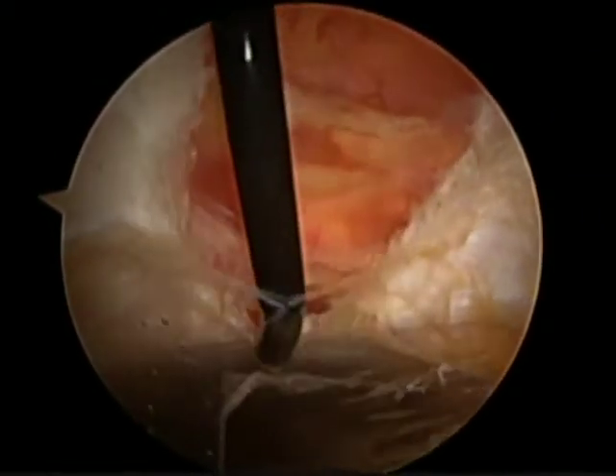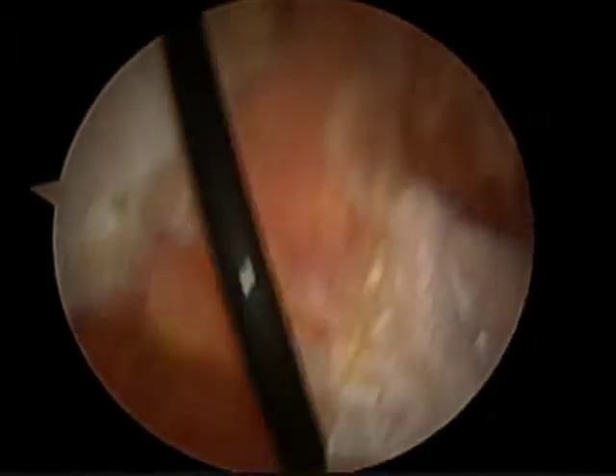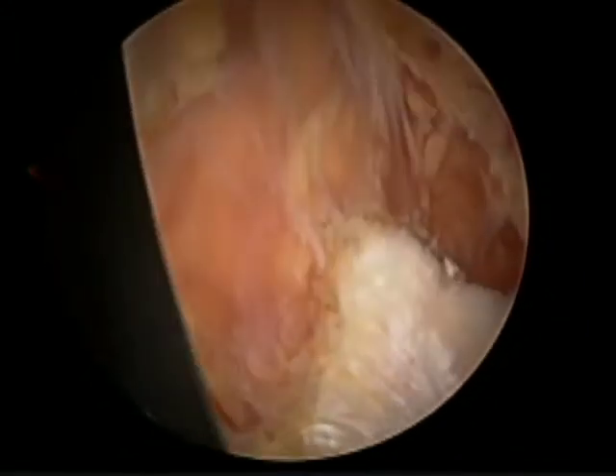We complete this cut all the way distally, anterior to the linea aspera insertion. That completes our iliotibial band release.